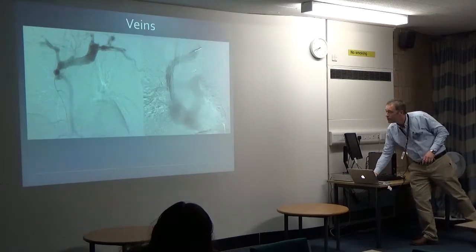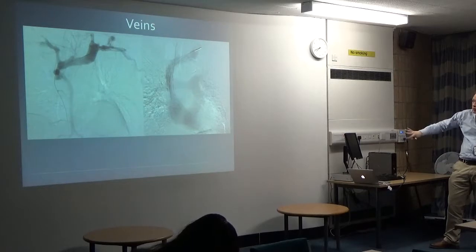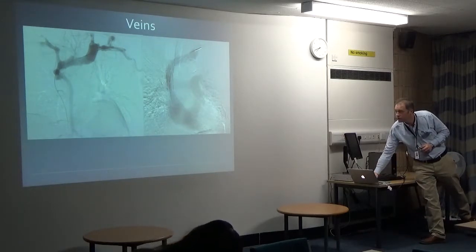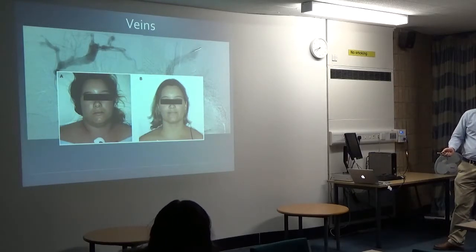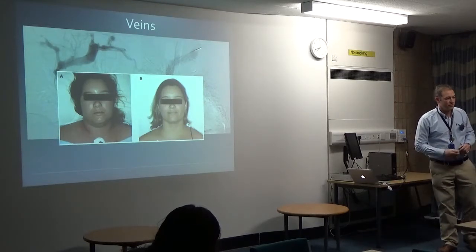But we can quite easily go through and just stretch this up and make that tube again so we can get the drainage from the head and arms right through back into the heart and beyond, and all the swelling goes down. And this is one of the nicest treatments that we can give. It's lovely because you see a patient. I'll show you this picture. This is the same person 24 hours later. So this is head and neck swelling. It's absolutely horrible. They feel awful. And then you go and see, and I've done this, you know, probably 10, 15 times. And you go up to the ward to see the patient the next day, and you walk past them because they don't look anything like they did the day before.